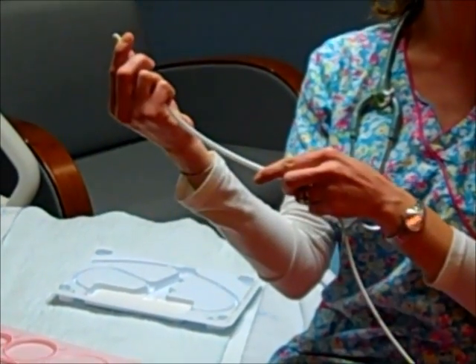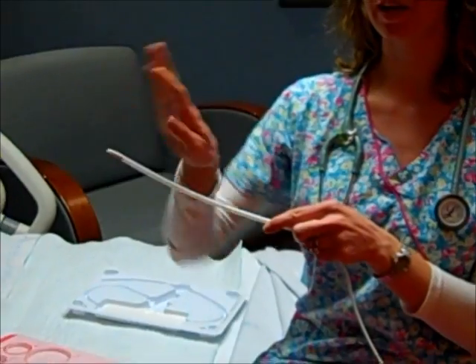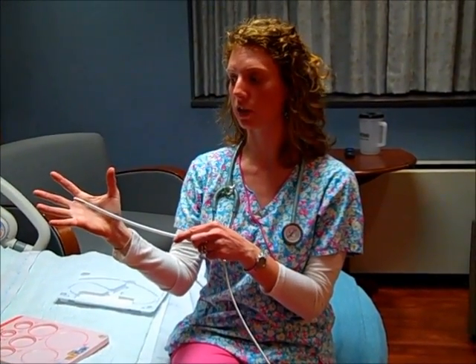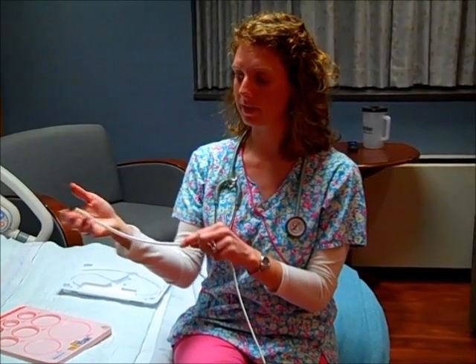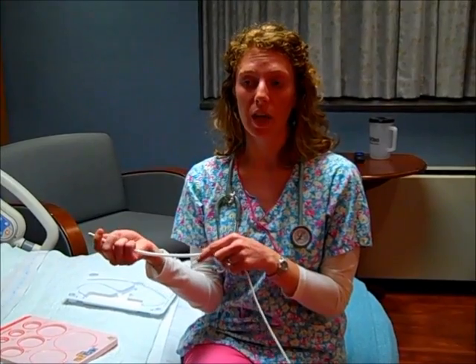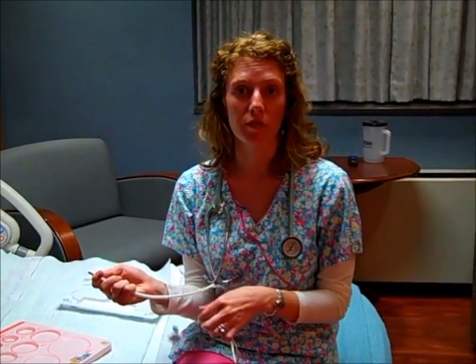It's sitting right up against the uterus so that it can measure the contractions, because the uterus is a muscle. So every time it has a contraction, it's kind of going to be pressing down on this pressure catheter, and you're going to get a reading. And you want your MVU units to be between 150 and 300.